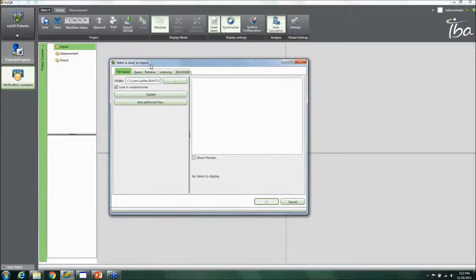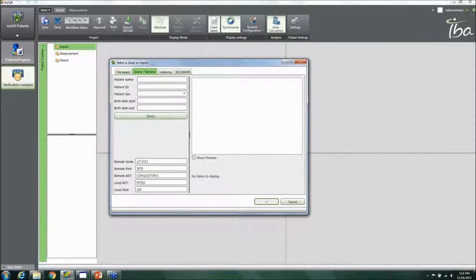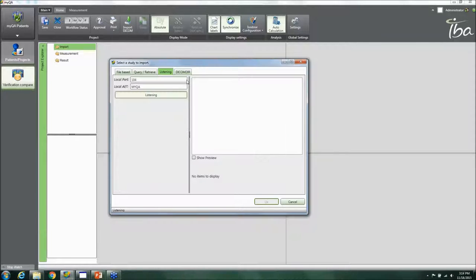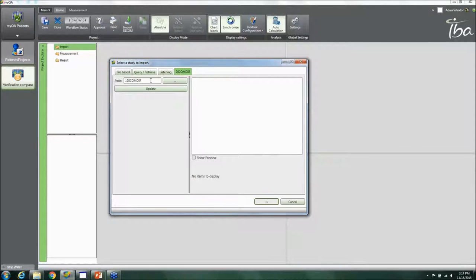When importing DICOM, you can use a file-based import query — navigating to a DICOM directory and searching by patient name to bring up patient information. If you have a DICOM listener set up, you can also push DICOM files directly from your TPS and they'll be automatically received. You can also set up a DICOM directory on your network, or simply browse to a local file folder.